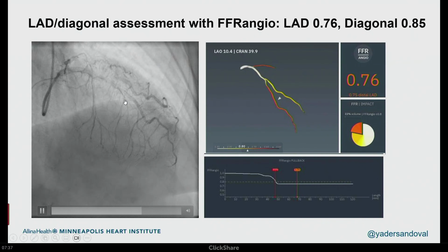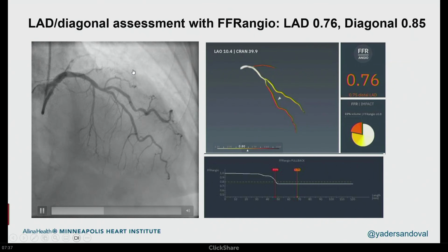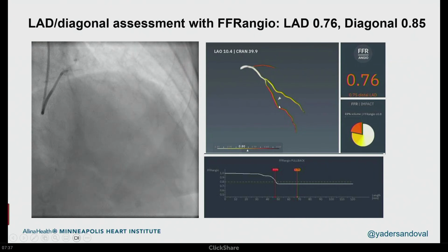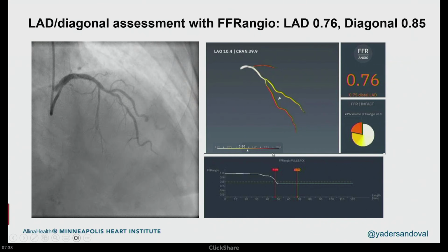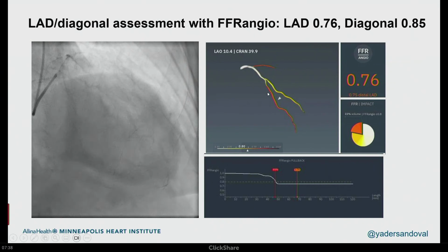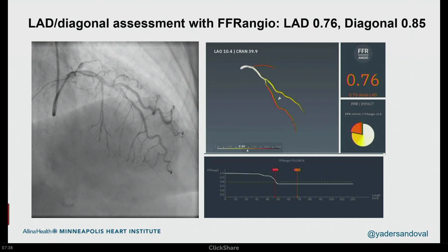This is how we do it. This is one of my cases. I had a middle LAD lesion. From the angiogram, you take 3 pictures, and from those 3 pictures, you can create these 3D reconstructions that take into account flow and vessel contour, and are able to estimate FFR from the angiogram. As mentioned already, this has been validated to be accurate. You can see that the FFR is 0.76. You can even do a lesion impact prediction of what happens to the FFR if you implant the stent, and pretty much this leaves no excuse to not do physiology in the lab. You don't need a wire, you don't need a drug, you just need to take good coronary angiography.